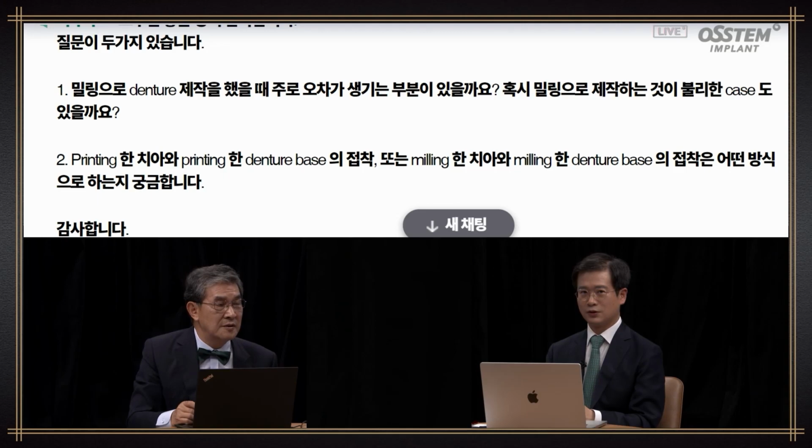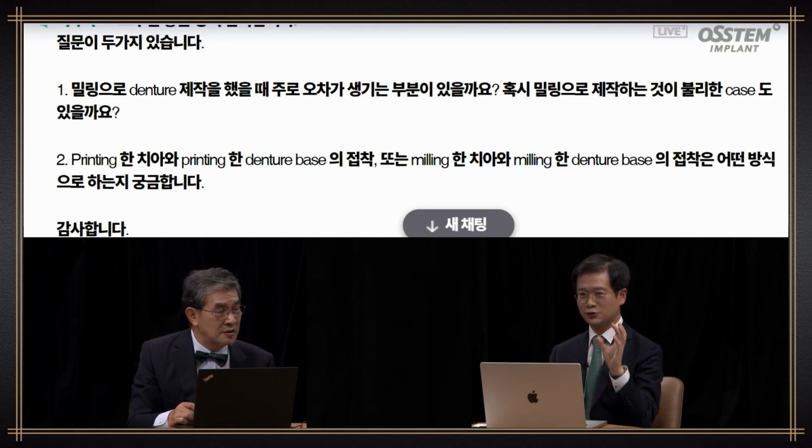With 3D printing, I use pink resin as the adhesive in the tooth pocket. So it's resin to resin, and no cement needs to be used. Yes, that's correct. But with the full denture, if you put it on one side, it pushes, so in the end it doesn't go in. So you have to use a jig to put it in accurately.